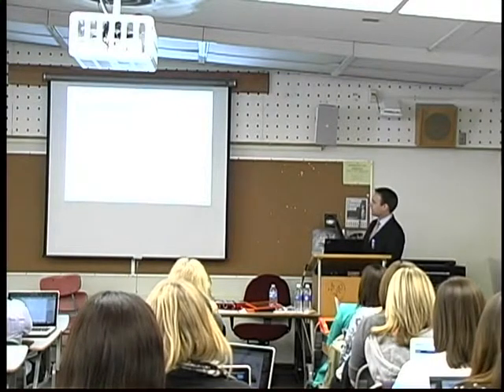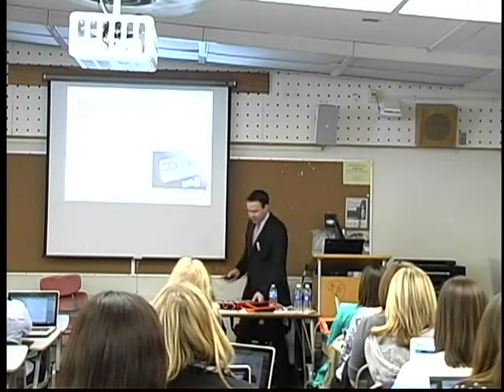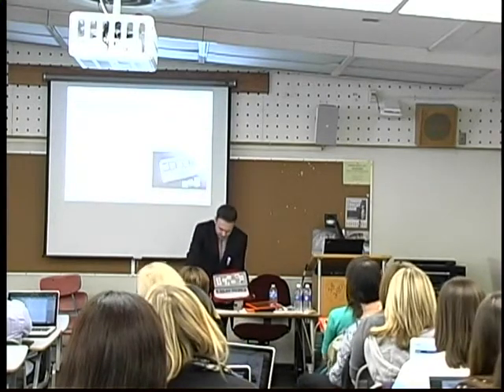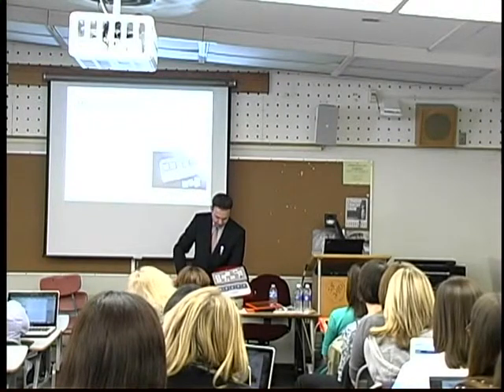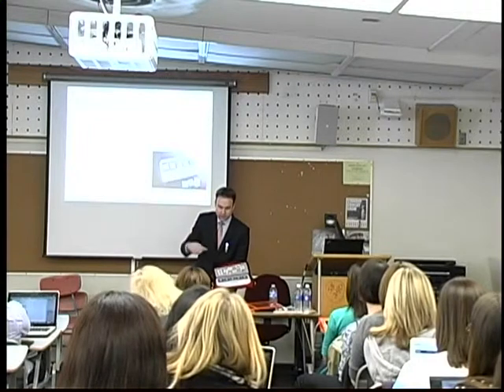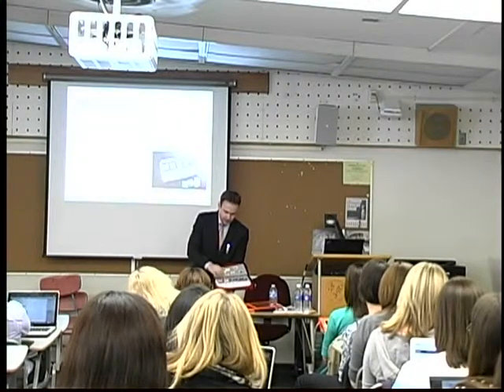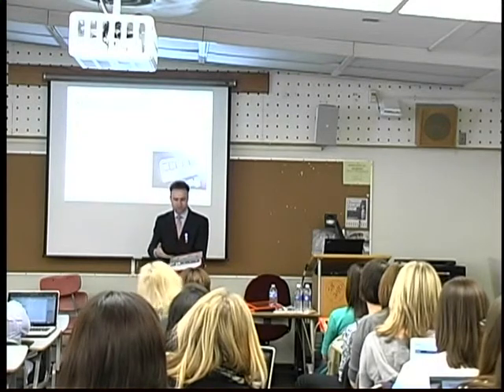and how many word approximations they would be making. At that time, the novelty or innovation was that a father of a child with autism had created this ProxTalker device. You can see it resembles the traditional PECS book quite a bit, but now instead of exchanging graphic symbols for a desired item, I can put those symbols on a sentence strip that actually speaks, and then this fairly simple device provides voice output.